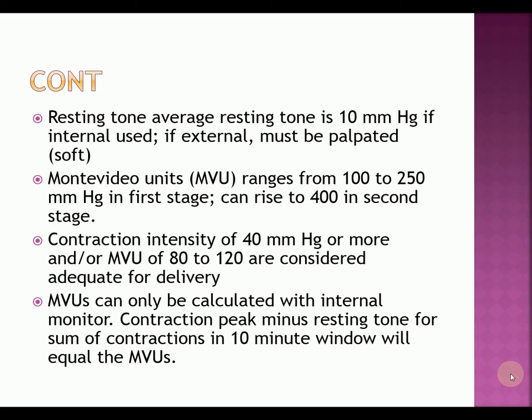I got ahead of myself, didn't I? Montevideo units range from 100 to 250 millimeters of mercury in that first stage, and can rise up to 400 in the second stage. Now, you may not know all about the stages. Well, you may know about stages because I know a lot of you have gone through that in your LPN program.